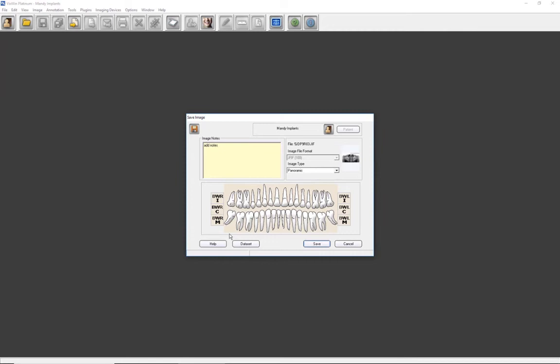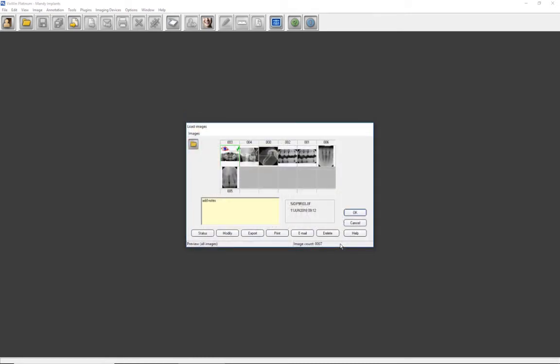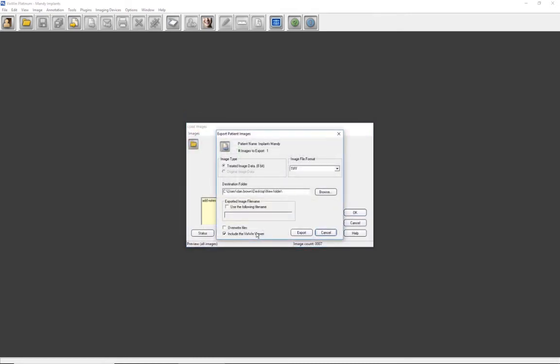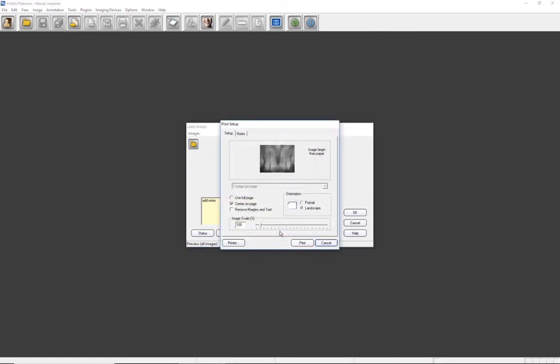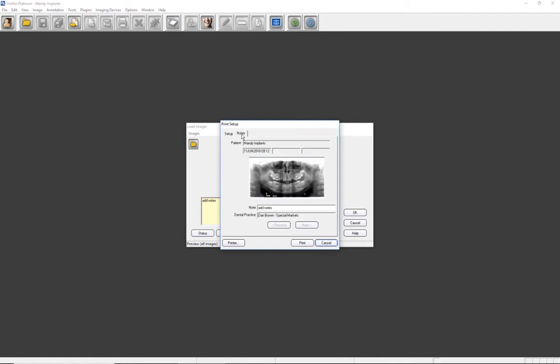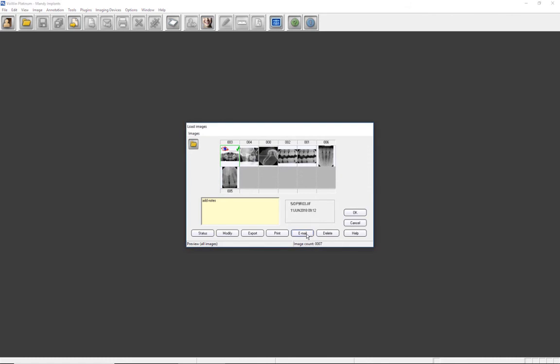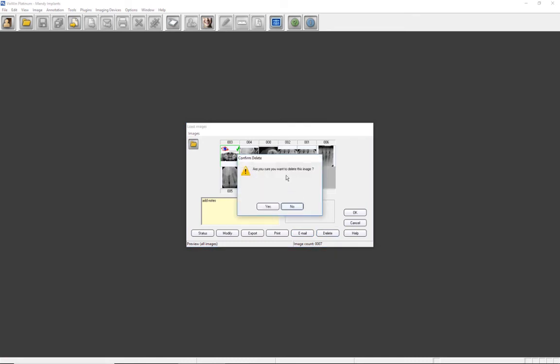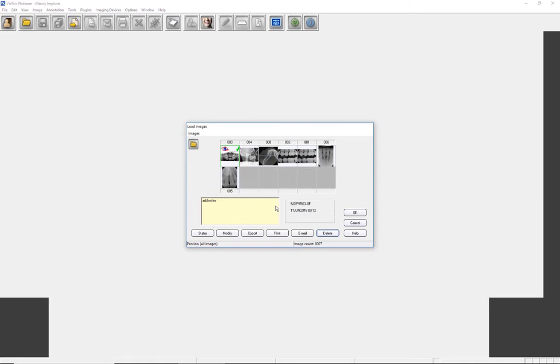Modify will allow you to select an image and make changes to its file format or classification, and to enter or modify notes. Export allows the user to change the image file format if desired, and export it to a destination folder on the desktop, to another computer on the network, or to a USB flash drive or CD. You may include a VixWin Viewer with it before you export the file. Print enables the printing of selected images — you will be able to add or edit notes included with the printed image. The email function will attach any or all images to your Outlook or Lotus Notes email programs. Outlook must be a 32-bit version. You may select an image and delete it if desired. Clicking on Help will open the VixWin Platinum User's Guide.